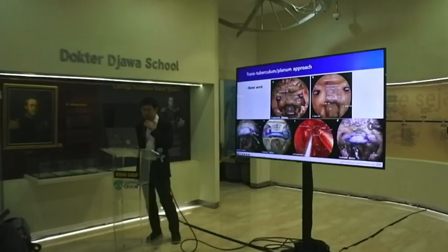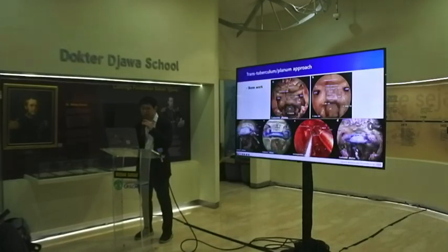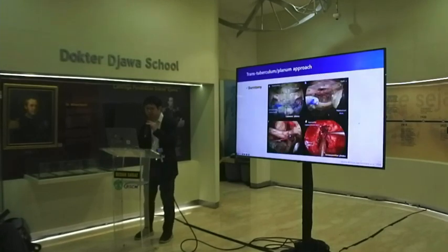So you should remove the bone above the sella, above the superior intercavernous sinus. How to drill and where to start the drilling first is dependent on the surgeon's preference, but always keeping not to injure the optic nerves or the optic and carotid protuberances is very important.